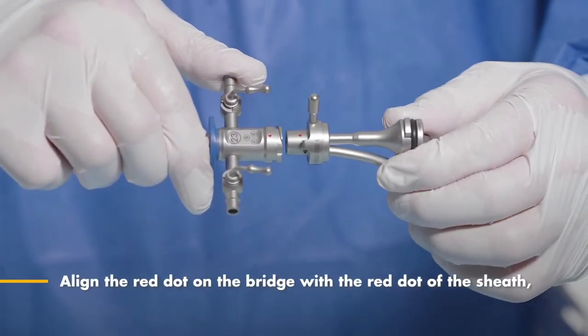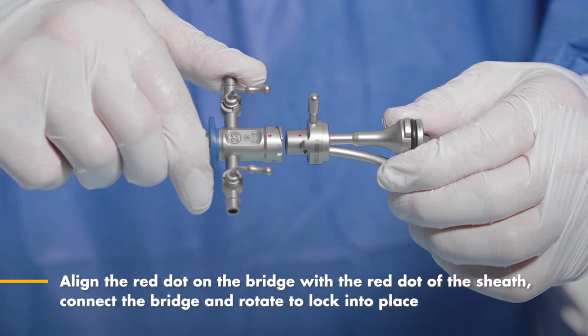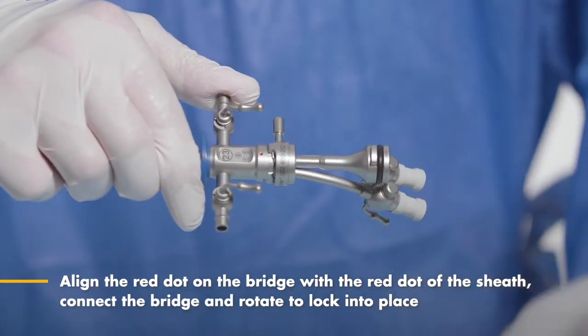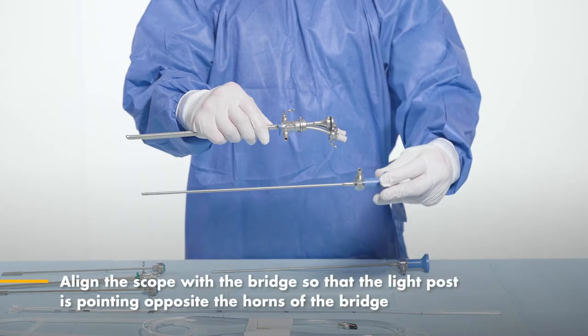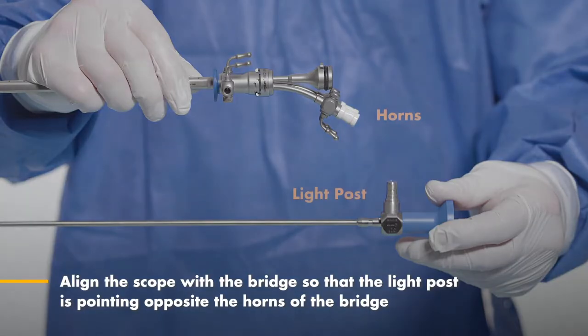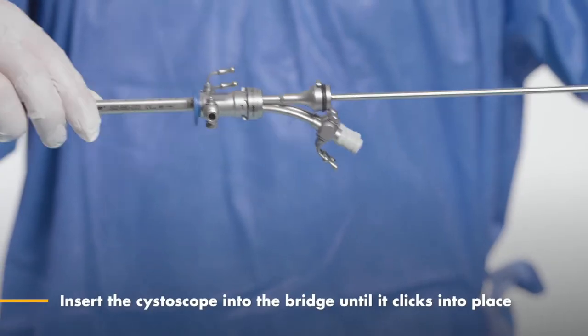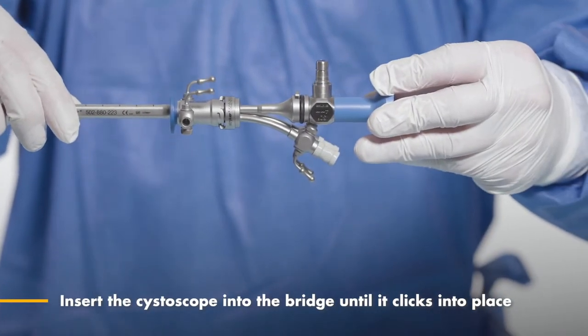Align the red dot on the bridge with the red dot on the sheath. Connect the bridge and rotate to lock into place. Align the scope with the bridge so that the light post is pointing opposite of the horns on the bridge. Lastly, insert the cystoscope into the bridge until it clicks into place.